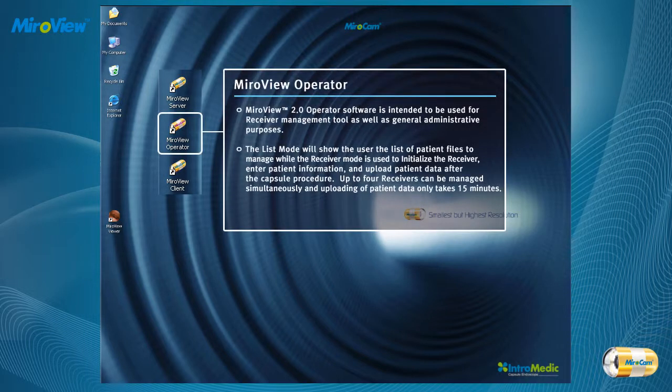MiroView 2.0 Operator software is intended to be used as a receiver management tool as well as for general administrative purposes. The list mode shows the user a list of patient files to manage, while the receiver mode is used to initialize the receiver, enter patient information, and upload patient data after the capsule procedure. Up to four receivers can be managed simultaneously and uploading of patient data only takes 15 minutes.